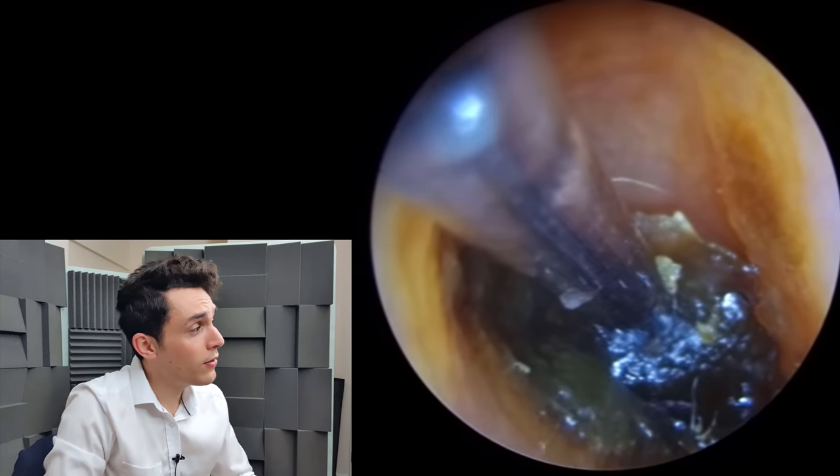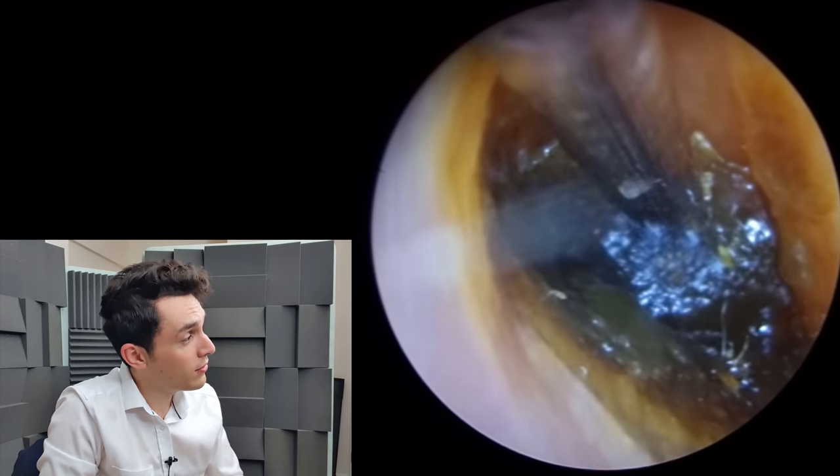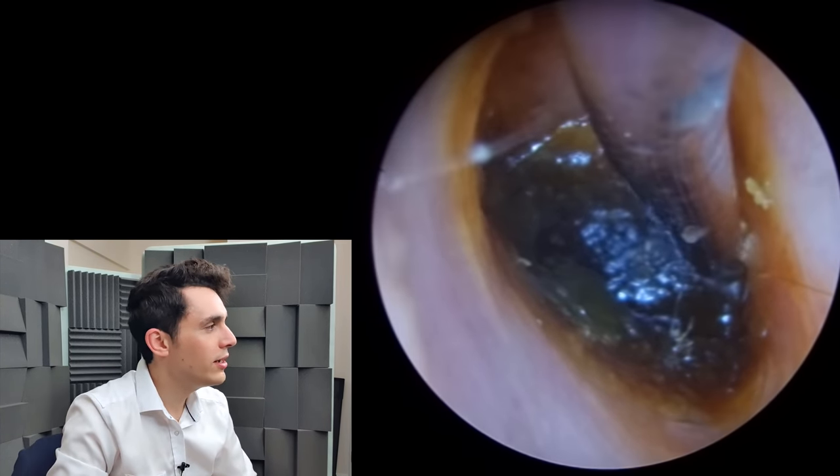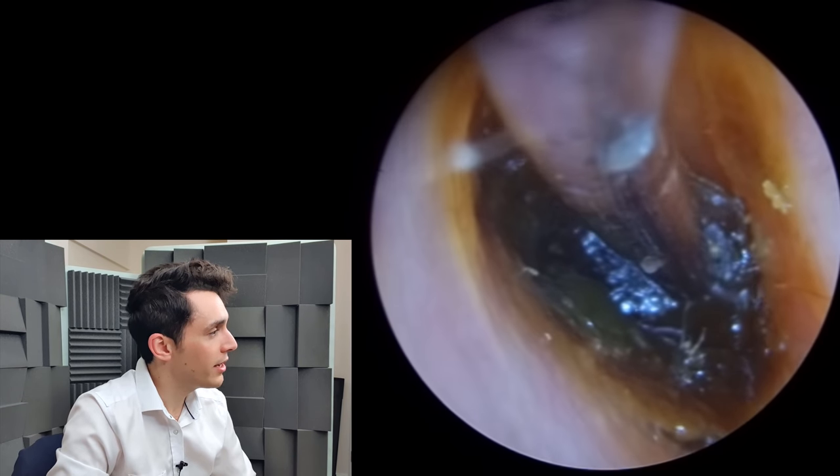As you can see, I'm going in at full strength with a fine-end suction probe and I can kind of move it around, but it's just really, really tough stuff. It is hard as nails.